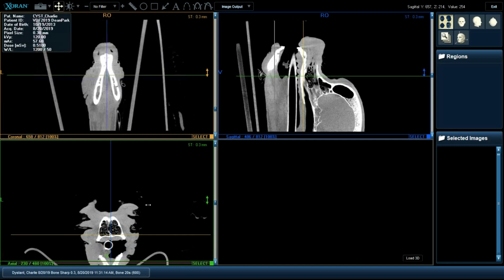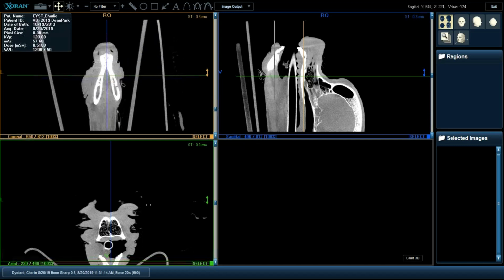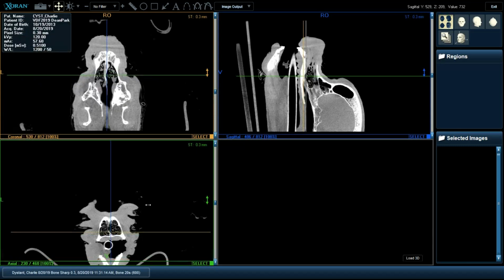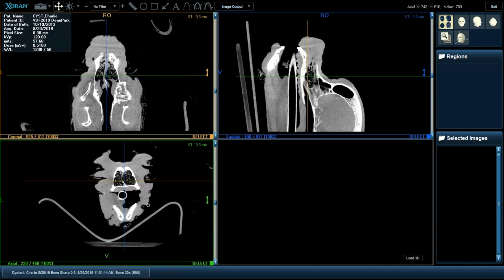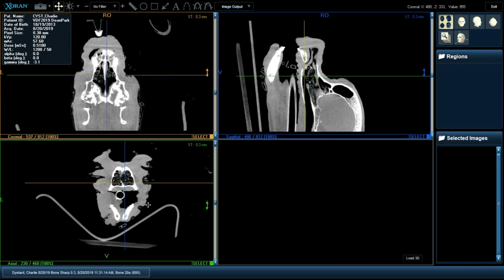For others, we still have to debate whether you want to use this exclusively. I think there's still room for 2D, of course. The cone beam CT might not be needed for every single patient, but certainly you'll be able to start seeing what was otherwise hiding.